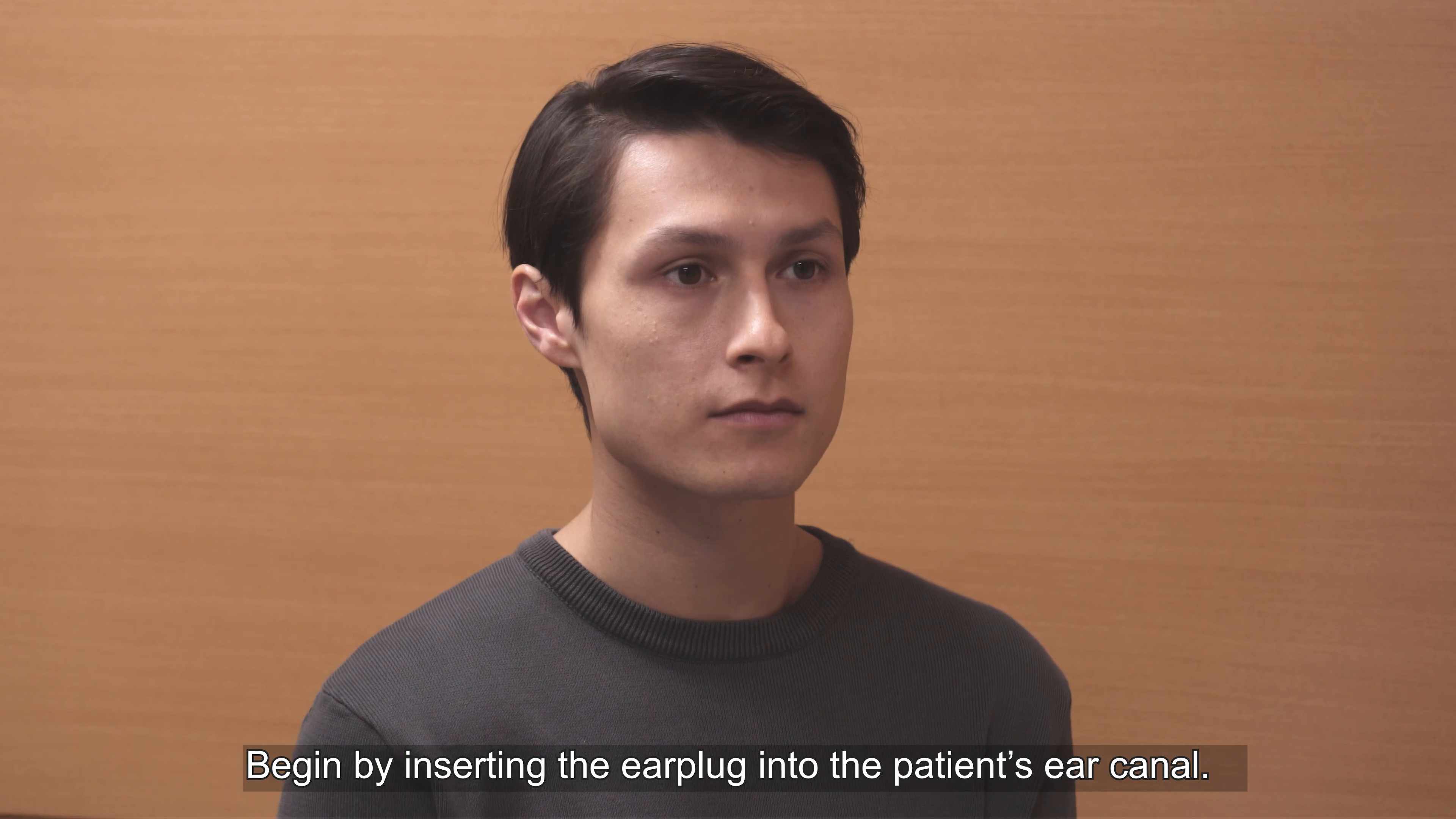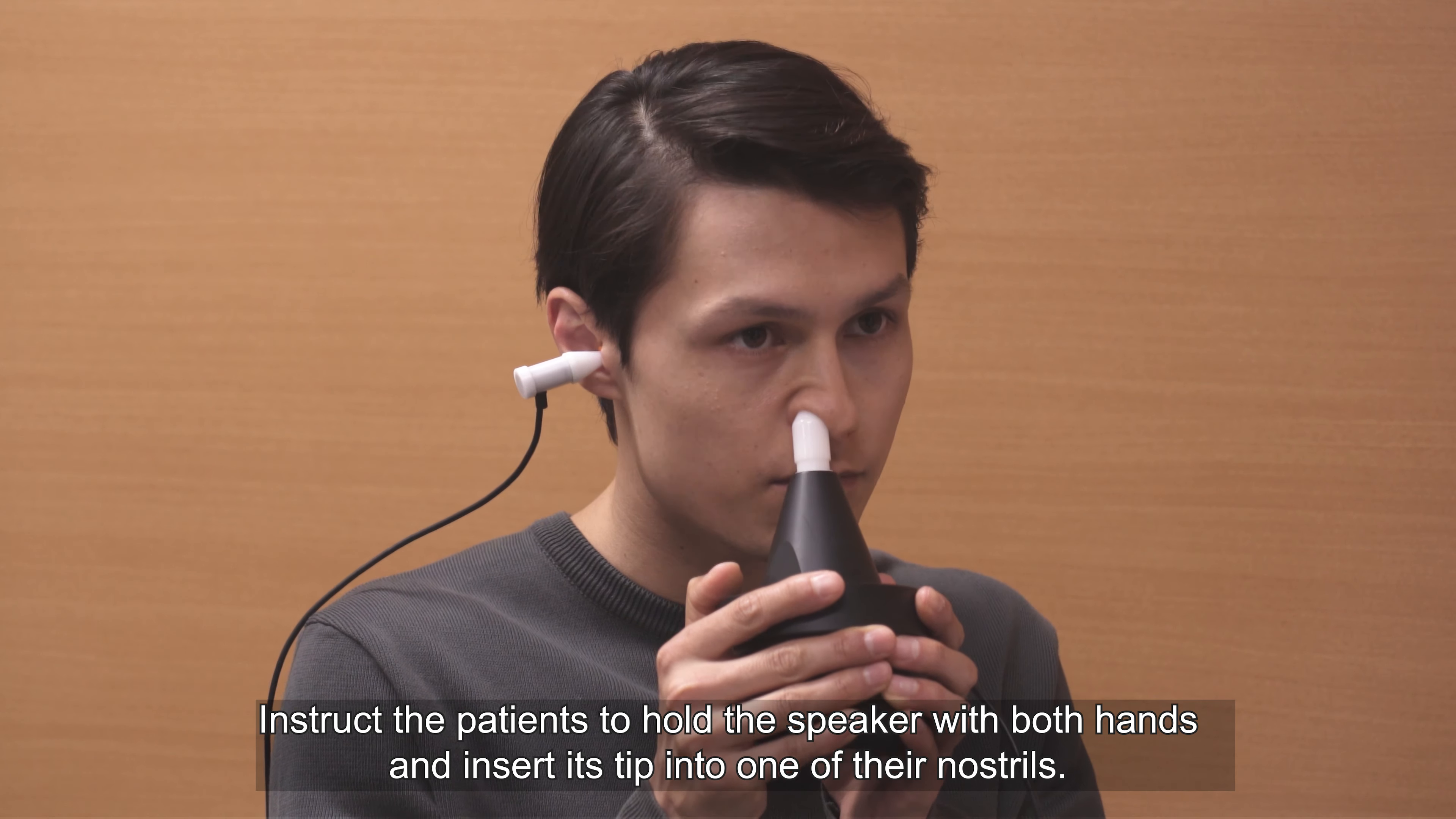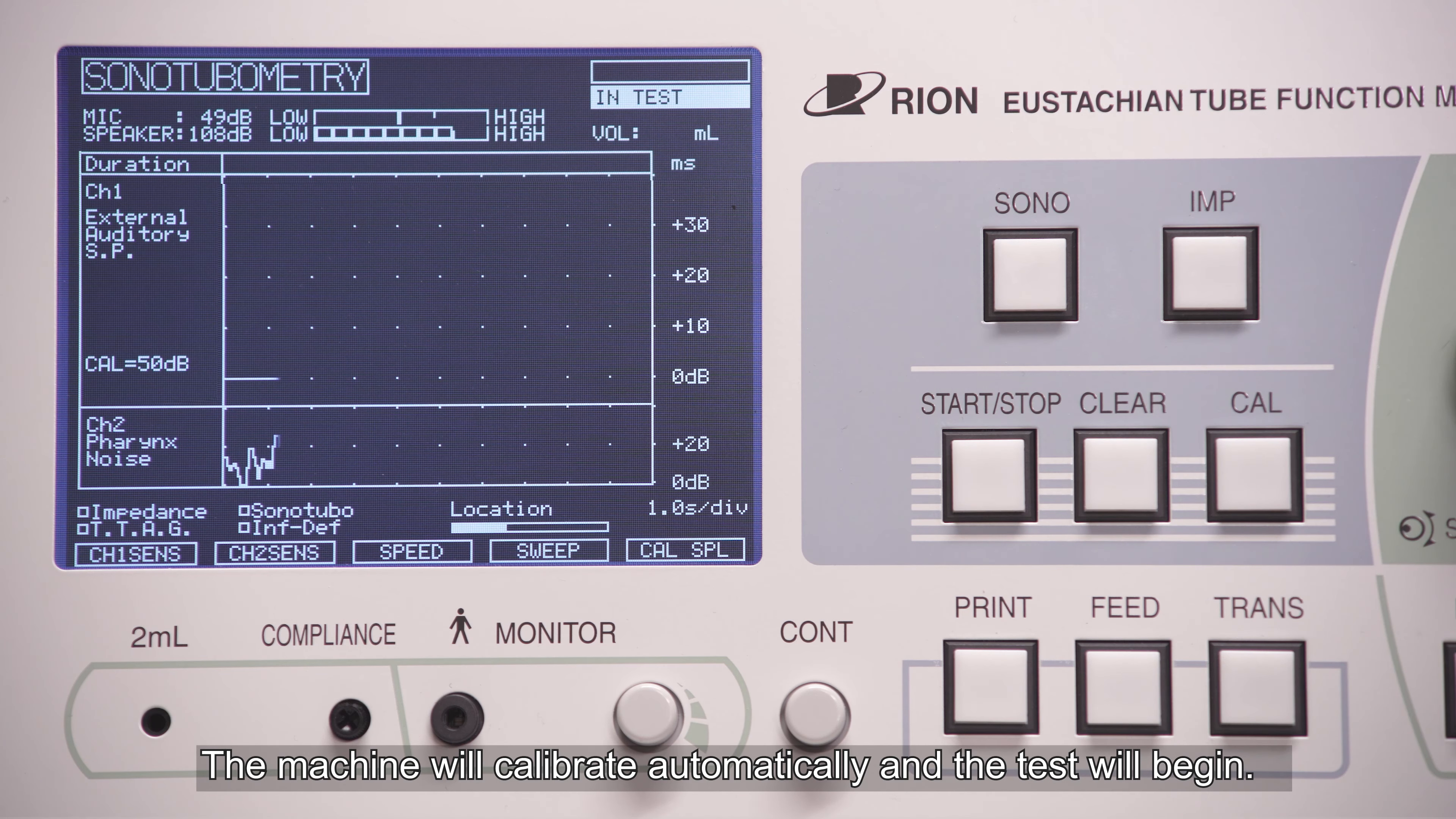This section will demonstrate the full test procedure. Begin by inserting the ear plug into the patient's ear canal. Instruct the patient to hold the speaker with both hands and insert its tip into one of their nostrils. Push the start stop button to begin the measurement. The machine will calibrate automatically and the test will begin.